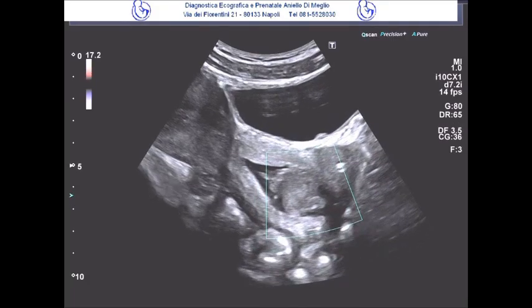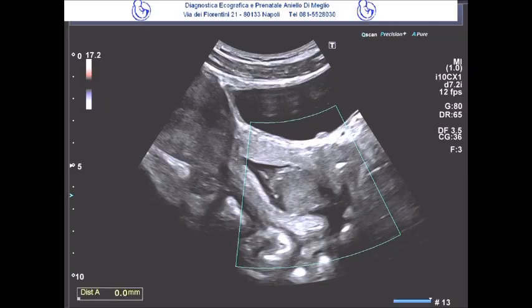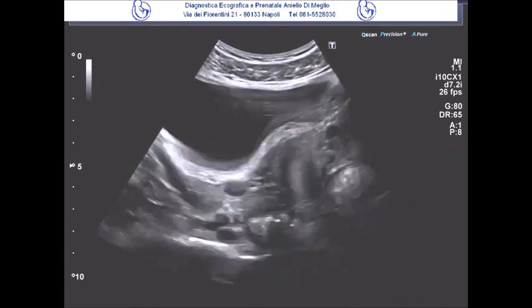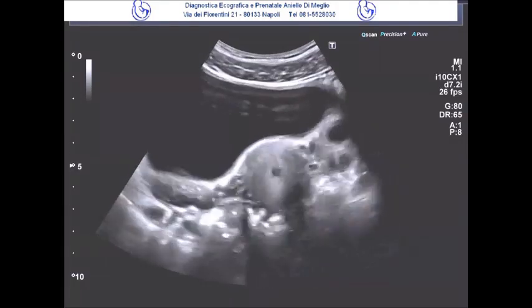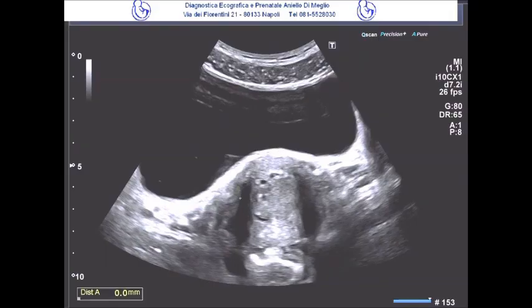Next, our focus shifts to the myometrial study, which is an examination of the muscular wall of the uterus itself. A particularly critical part of this stage is the precise measurement of the cervical neoplasm. To fully characterize its size and extent, we are systematically measuring it in 3 dimensions. Right now, we are capturing the transverse dimension to determine its width.